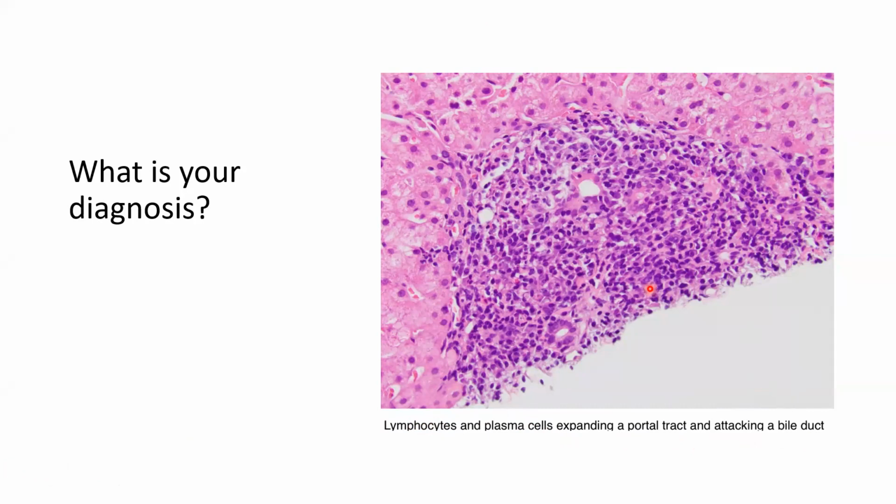No, we said when we see plasma cells, what are they diagnostic of? Right, biliary destruction happens in primary biliary cirrhosis, but we have the presence of inflammatory cells, and among them plasma cells. Here I don't see macrophages. In primary biliary cirrhosis the most important inflammatory component is macrophages and granulomas. Here there are no granulomas, there are lymphocytes and plasma cells. What do you think?